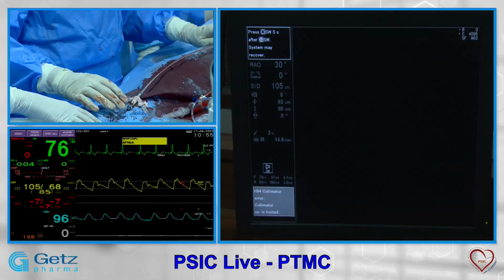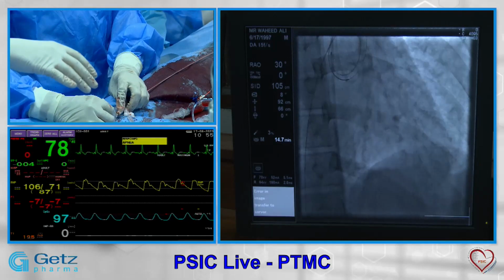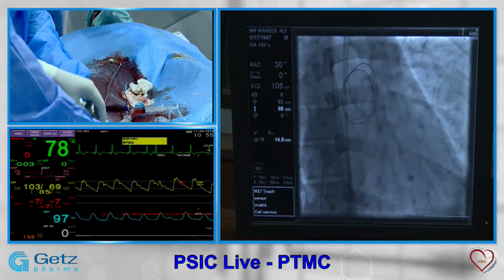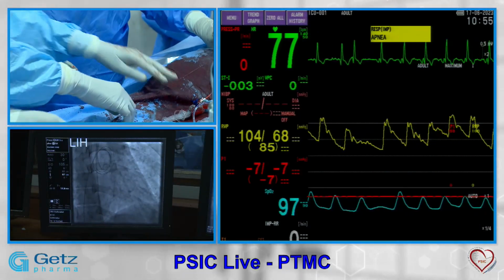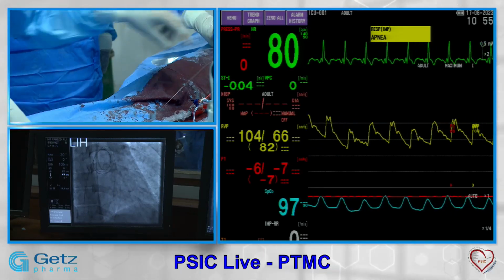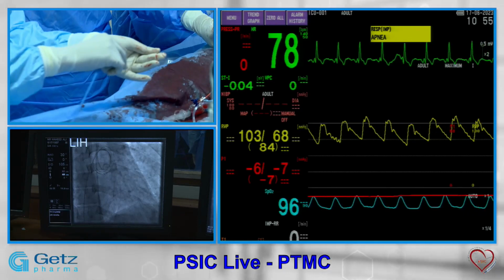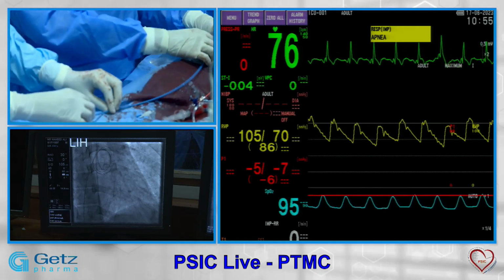Okay, so now we will be looking at the pressures, and we'll take the Mullins sheath again in. Out balloon now. So meanwhile we are looking at the pressures. I think that we have got a few minutes, and we will be discussing some of the slides for the complications.